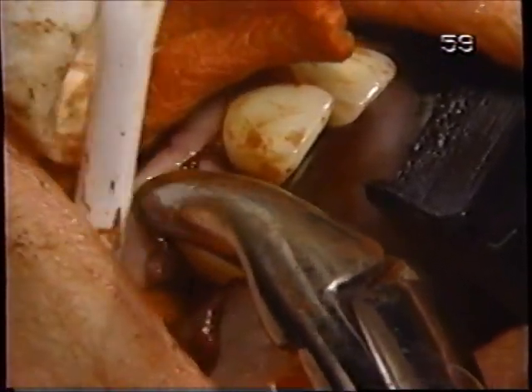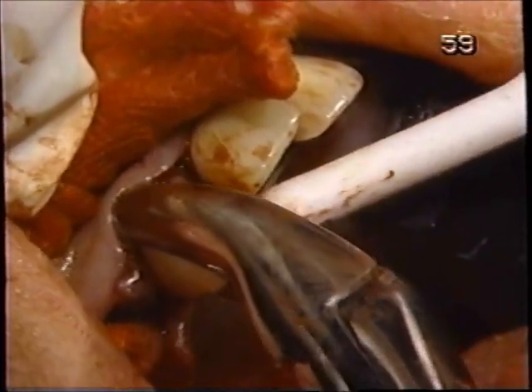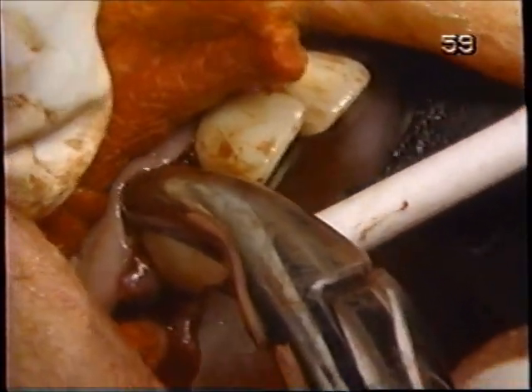Forcep beak down on bone, en route. Rotational, buccal lingual.